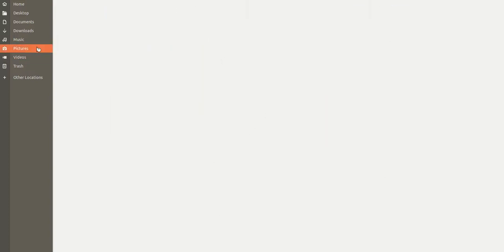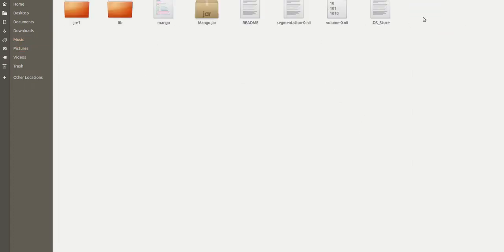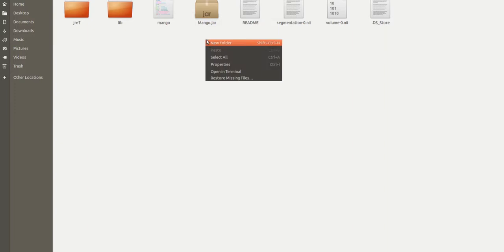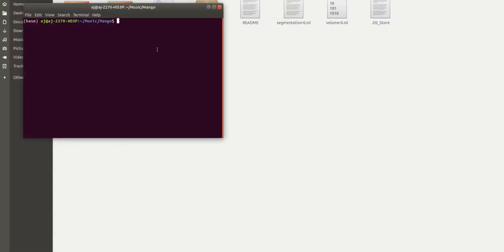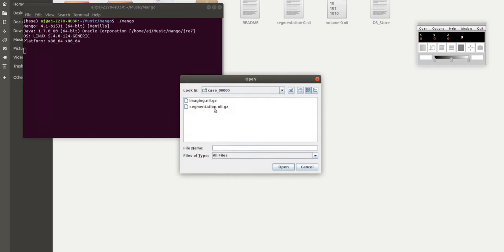Let me open a tool for visualizing this. There's an open-source tool available for visualizing 3D data called Mango. It's a Java application.